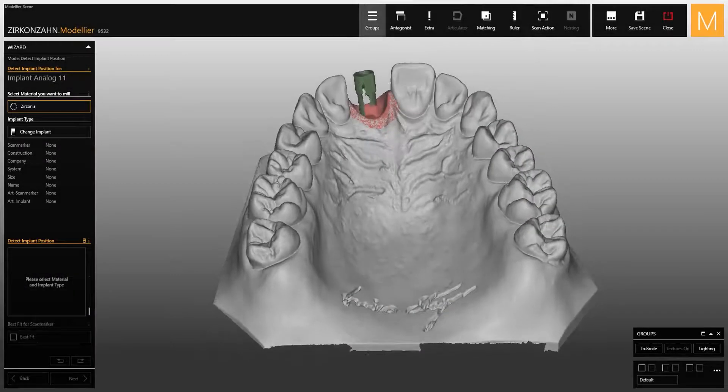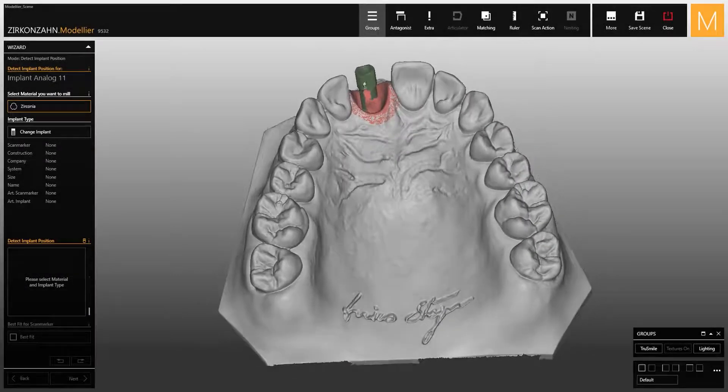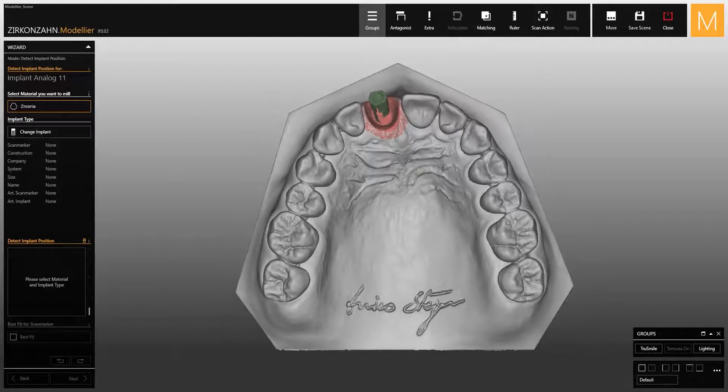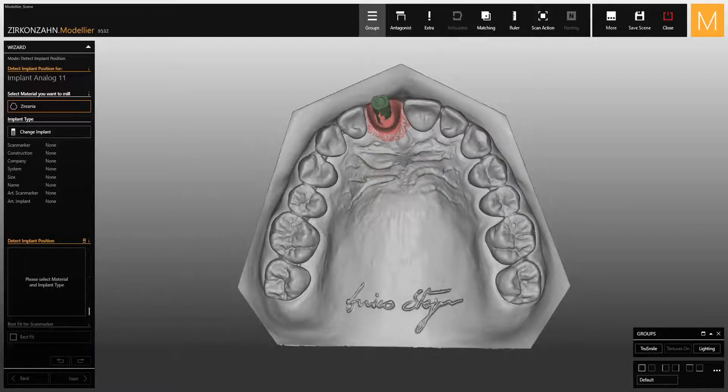This video shows the workflow for modeling a restoration with the new K80 angled screw channel titanium bases.